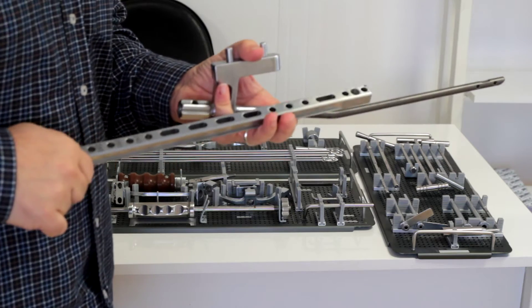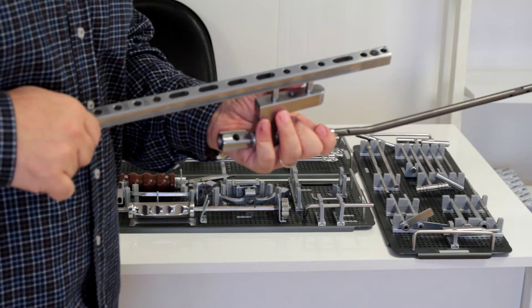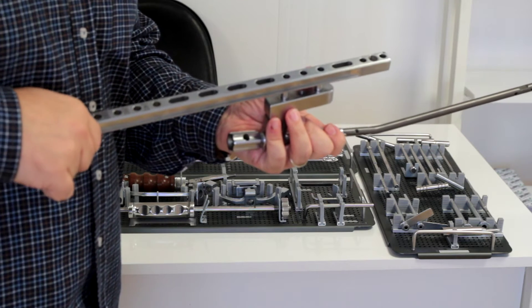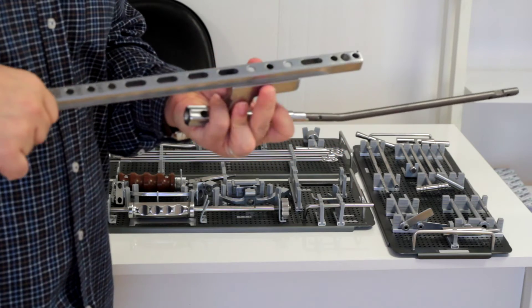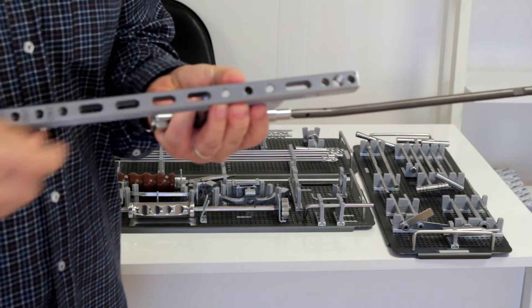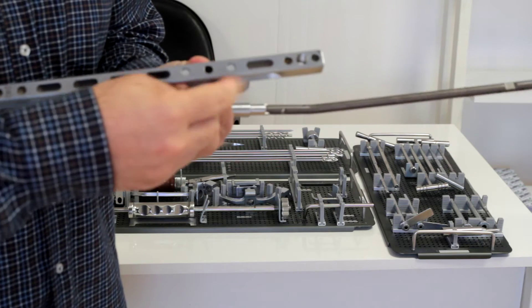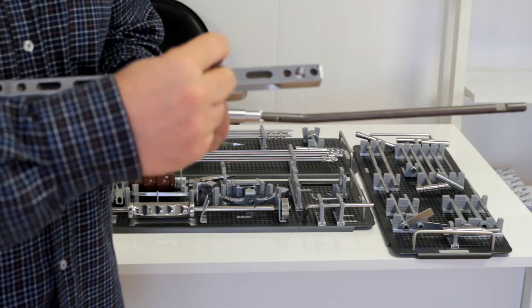Remove the guide bar and we will replace it for the proximal locking here. You should place the guide bar to these holes and tighten.